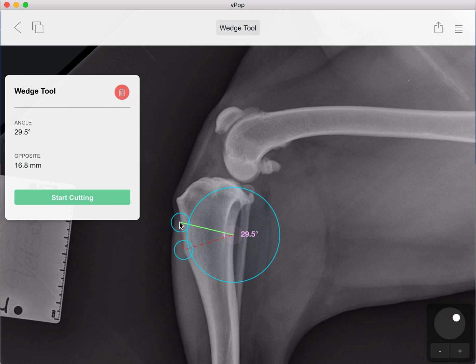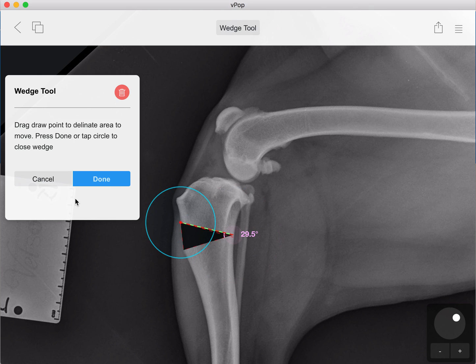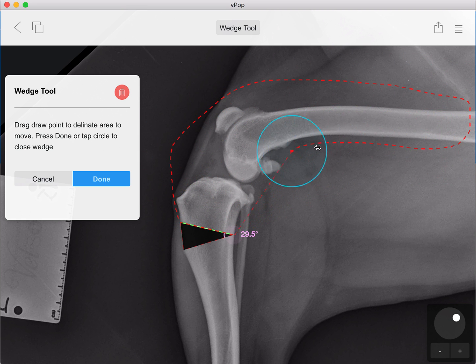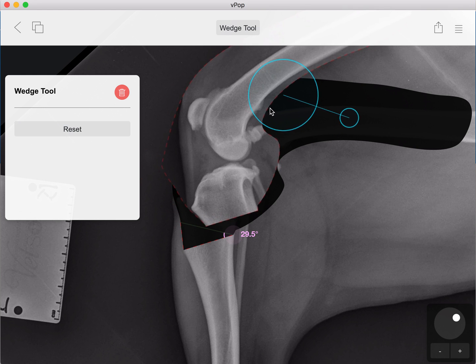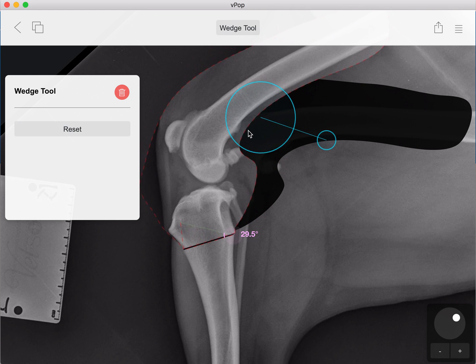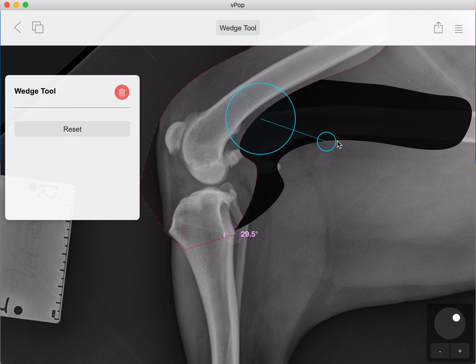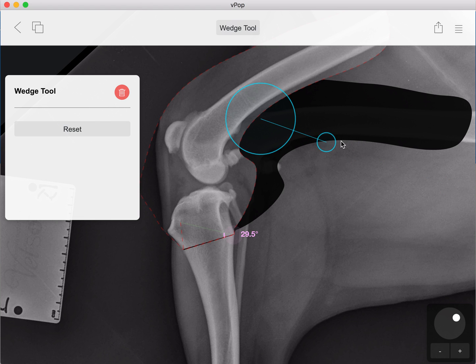The significance of the green line is that it is where you delineate your fragment from. So we're going to start cutting to remove the ostectomy, and then for the final step delineate from our green line back to the origin and click done. Your ostectomy is now reduced and you can move, using the large blue circle, wherever you want your fragment to be. If you need to rotate it, use your rotation arm here — for a greater degree of control, bring it out to the side and you have a greater distance to move on the circumference to control your rotation.